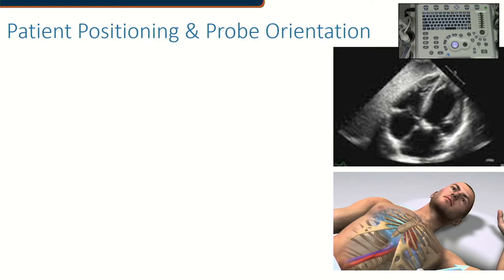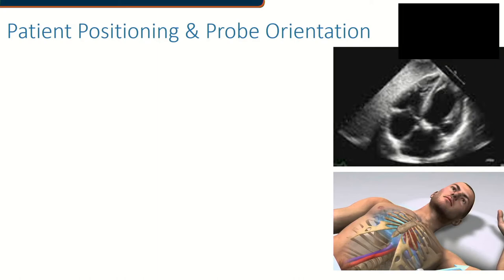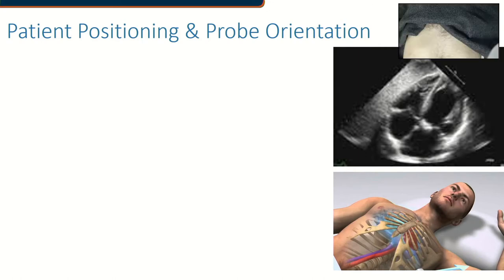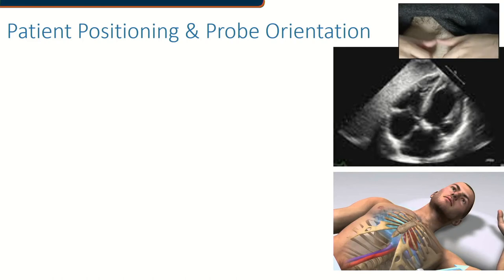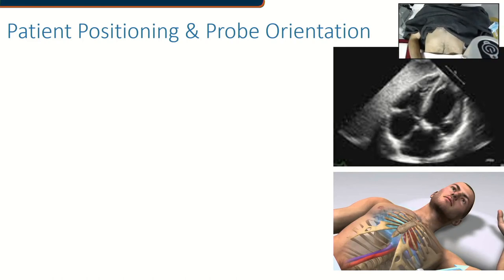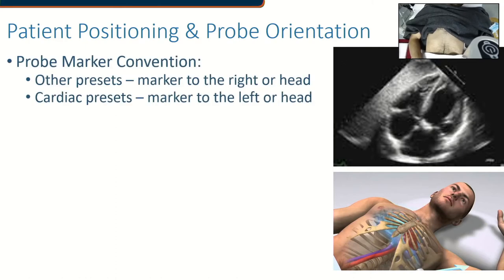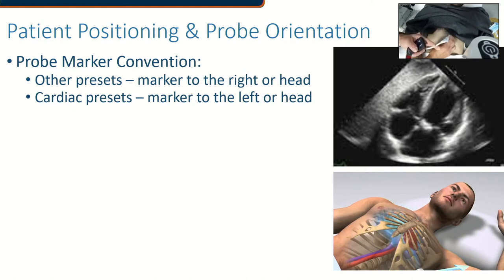Now let's think about patient positioning. We're going to go back to our patient on the bed. Here we can see our patient, Atif, laying on his back. Our presets have the probe marker in cardiac mode to the patient's left, or in a long axis toward the patient's head.